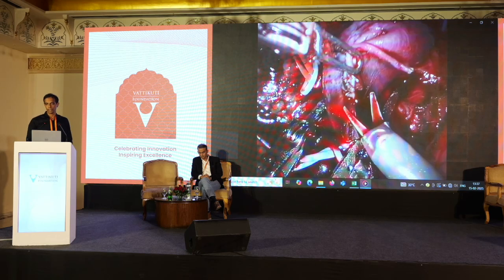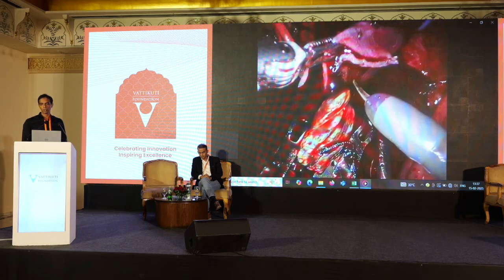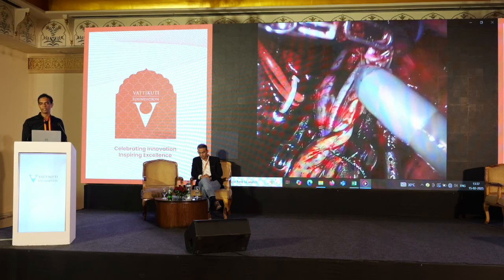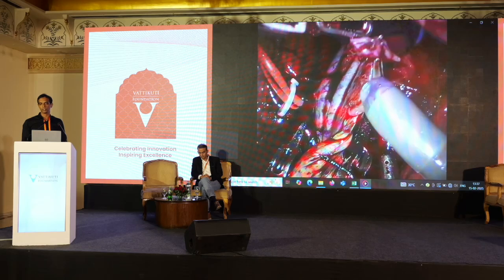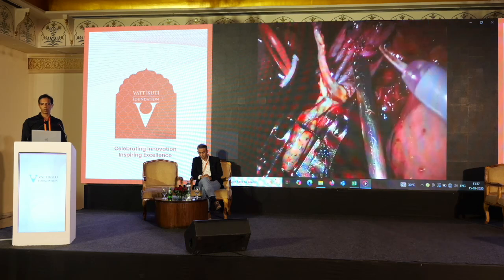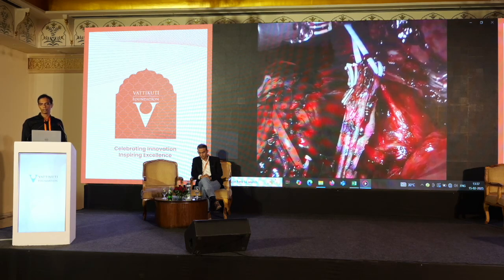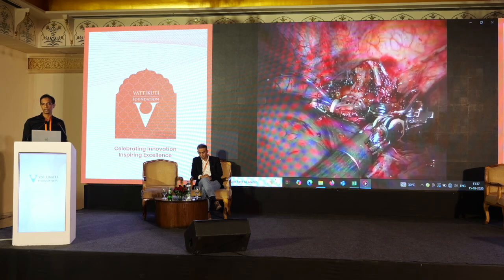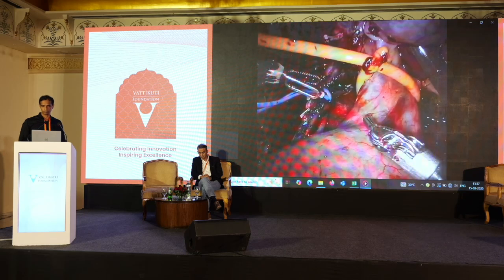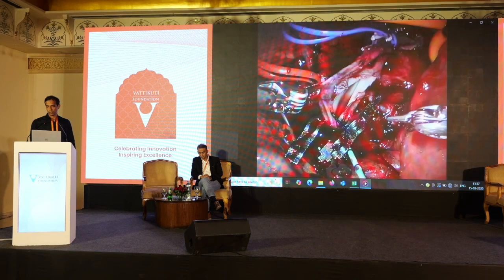Here we are doing the IVC thrombectomy. Now the urology team comes into play. During the IVC thrombectomy, we are also resecting the stapled margin here, as this is a left-sided renal cell carcinoma. So we are removing the stapled margin. You can see the thrombus attached to it. The thrombus is removed in entirety. It is also confirmed with transesophageal echocardiography and the drop-in probe again that there is no residual thrombus. Then all the clamps are released and we see that there is no residual thrombus.